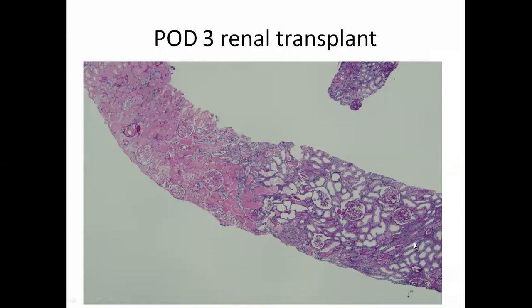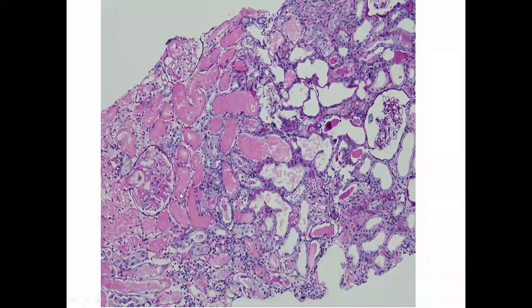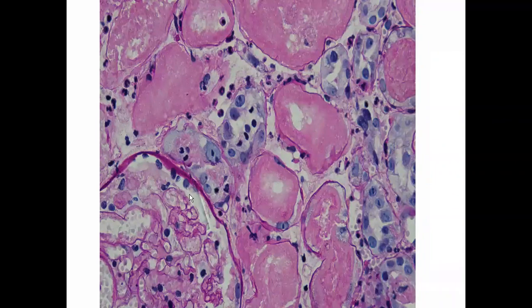So if you look at this necrotic cortex, just compare it with the very blue looking cells. What you can see here, it is more pink. So whenever there is a necrosis of the tubule or necrosis of the renal tissue, it appears less blue and it appears more pink. Okay. This is a high magnification of these necrotic tubules. You should remember that whenever necrosis occurs, the first tubules which go are proximal tubules.